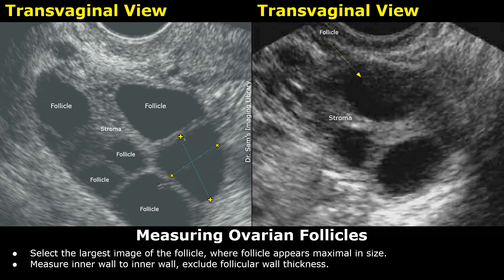First, we identify the follicle we want to measure and carefully scan through it in both planes. We scroll or sweep slowly until the follicle appears at its maximum size. This is the frame where the follicle looks largest and most well-defined. It is important not to measure the first image we see, because follicles are three-dimensional structures and measuring them off-axis will underestimate their true size. Once the follicle appears largest on the screen, we freeze the image.